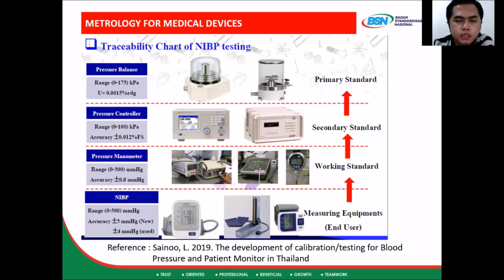And this is the traceability chart of the NIBP testing. I got it from Mr. Liquid Sino from NIMT Thailand. This NIBP device is traceable to the pressure manometer.